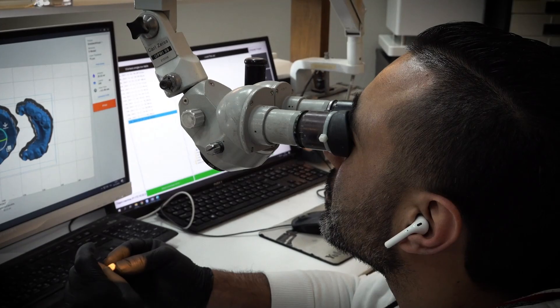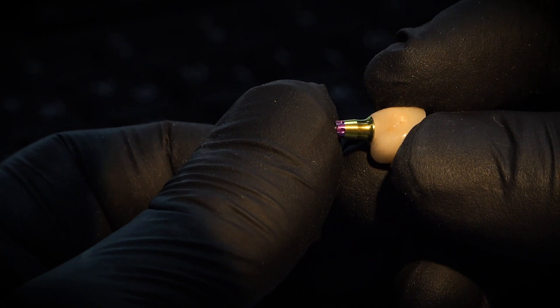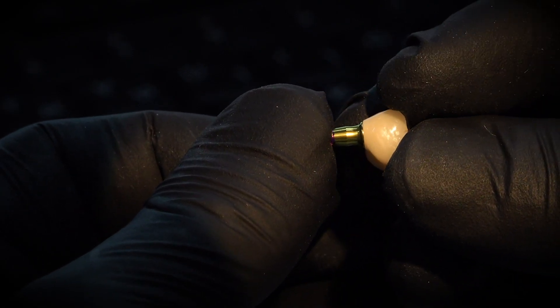Now, back to the microscope for a second quality check of crown tie base assembly. Wait for the cement to cure.